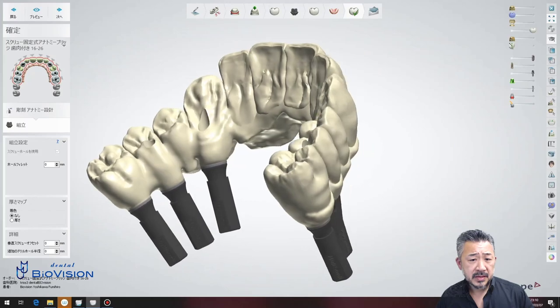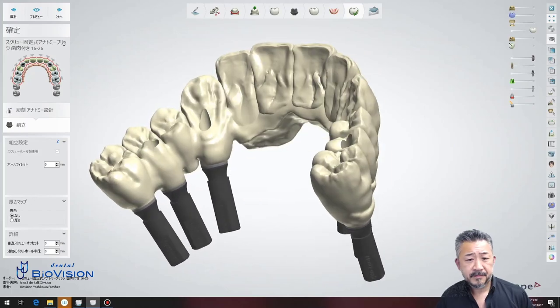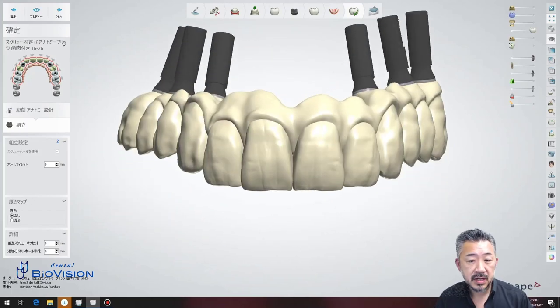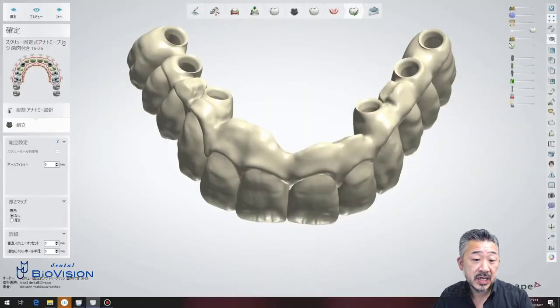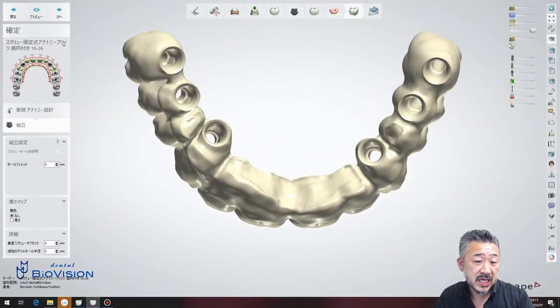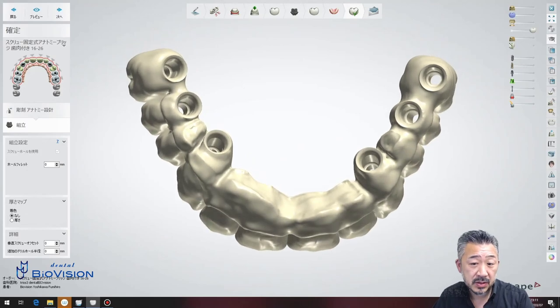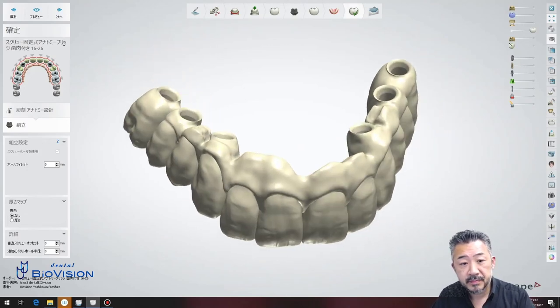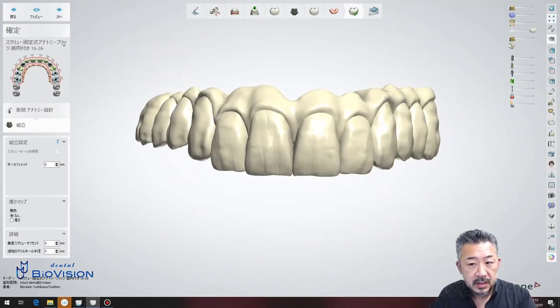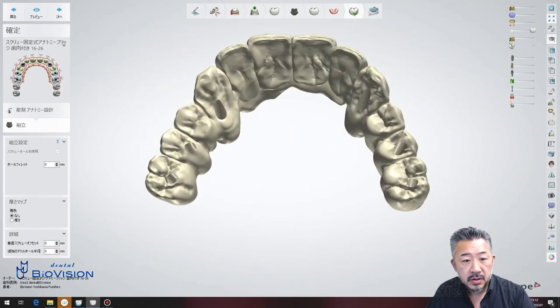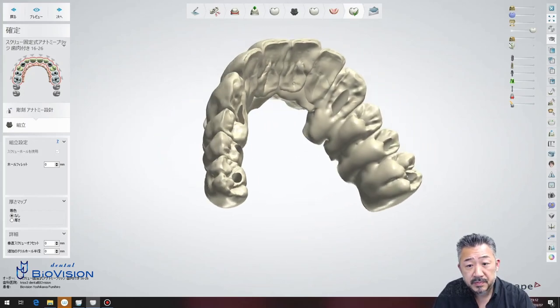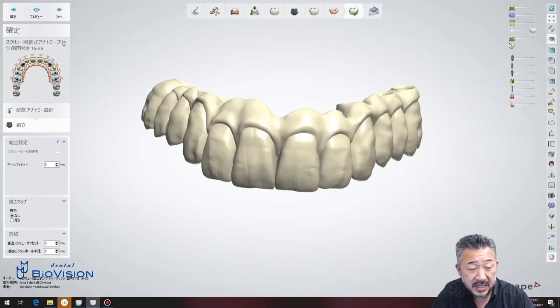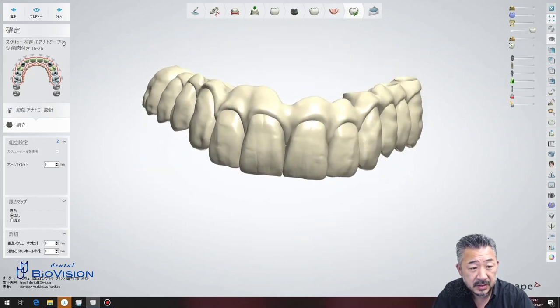After this, the exported STL data is imported into the milling machine software for nesting. It is important to be able to reproduce this realistic design.